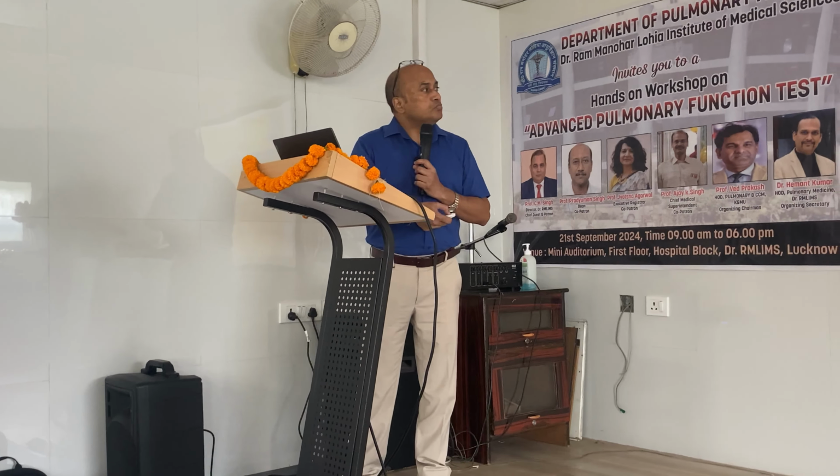To solve this problem, the machine came that is called the body plethysmograph. The body plethysmograph measures whole gas in the lung, either communicated or not communicated. In fact, like gas trapped in a bulla, body plethysmography measures total thoracic volume. Another advantage of the body box is that it is a fast method to obtain the thoracic gas volume compared to the dilution method.